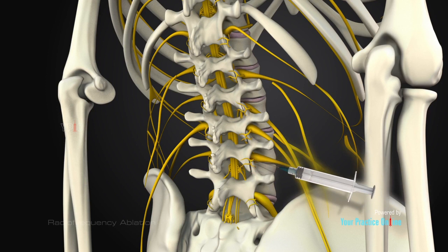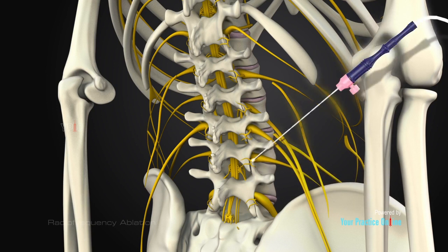Facet joint injections relieve pain for a short duration, whereas radiofrequency ablation can keep you pain-free for a much longer period. If your pain is relieved from the injection, then RFA can be performed for long-term relief.